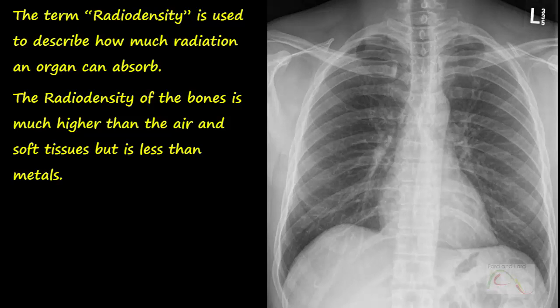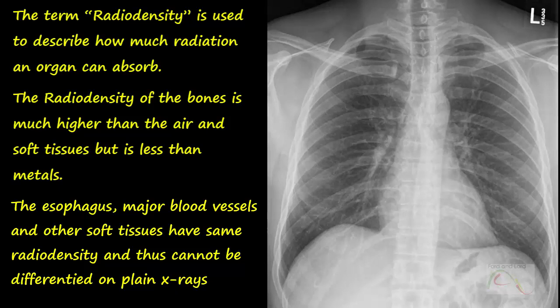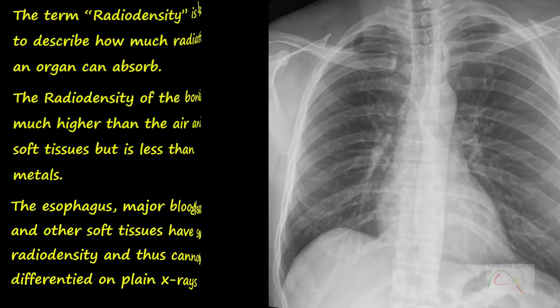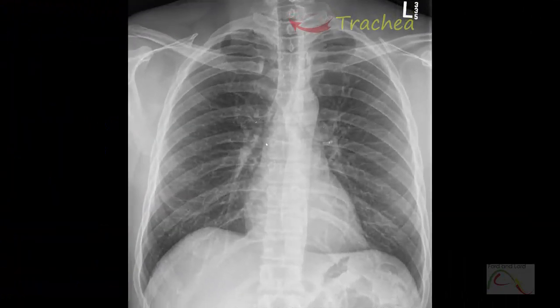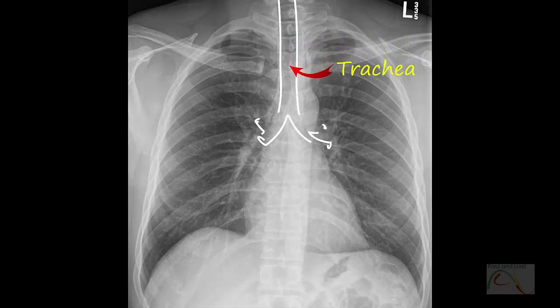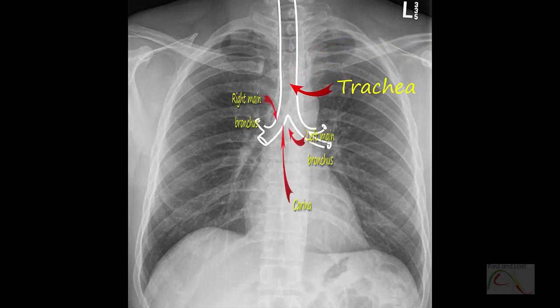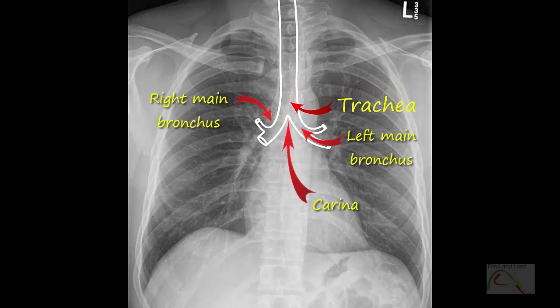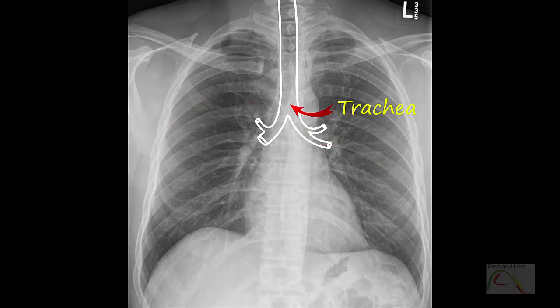If two anatomical structures absorb similar quantities of x-rays, it becomes difficult to distinguish them from the image. The most common purpose of the chest x-ray is to assess the lungs, airways, and cardiovascular system. The large airways are visible on good quality chest x-rays and appear darker as they contain air. The trachea branches at the carina into the right and left main bronchi. Bronchi can often be followed into the hilum as they branch further, but are difficult to follow beyond the hilum. Tracheal deviation to either side usually points to some pathology.